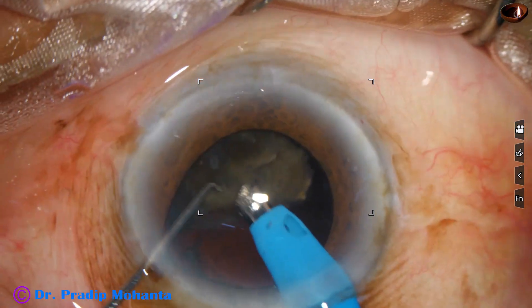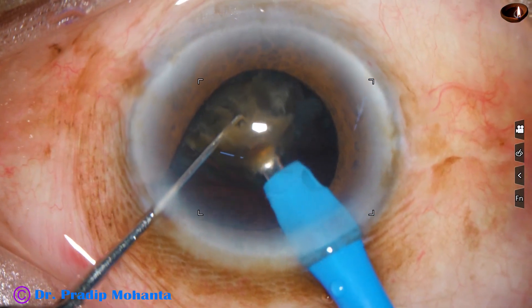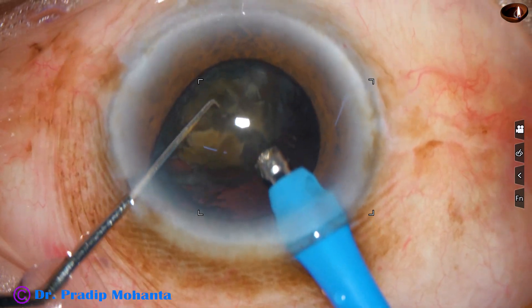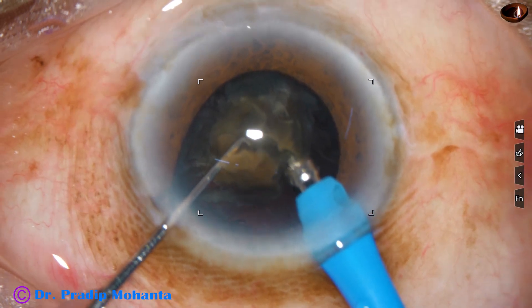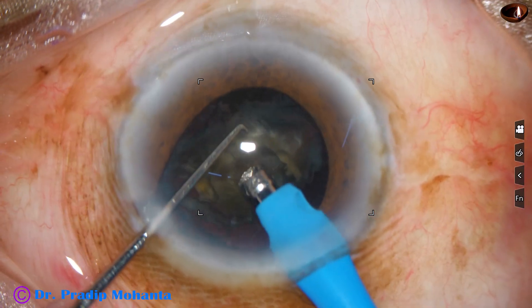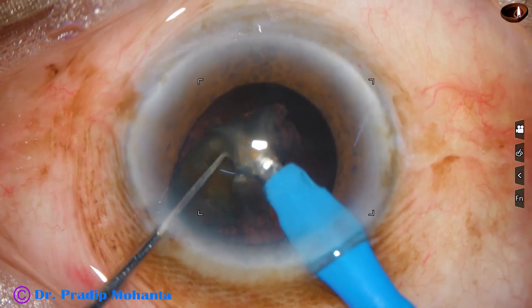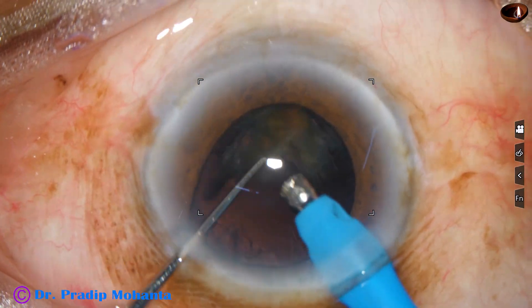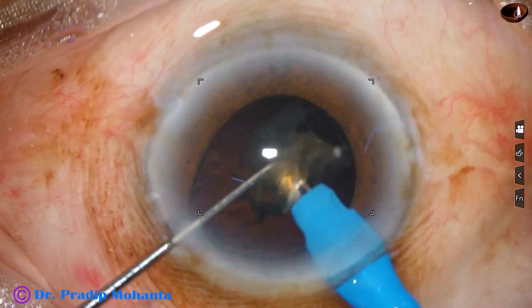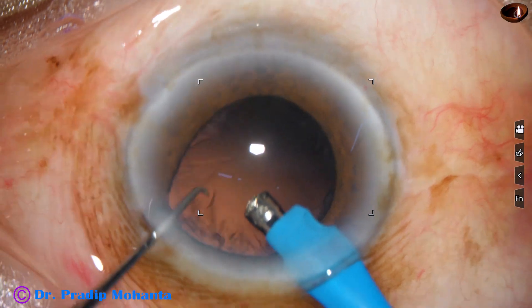We come to the last piece. At this time, I ask for lower parameters — vacuum is reduced to 300, flow rate to 30, and ultrasonic energy to about 80%. Very carefully and slowly, the last piece is emulsified. I am trying to separate the epinucleus from the nucleus so that the epinucleus forms a shell, but the epinucleus has come out and the posterior capsule is just next to the hard nuclear bits. So I have to be very careful at this time — be more slow. And it is done.